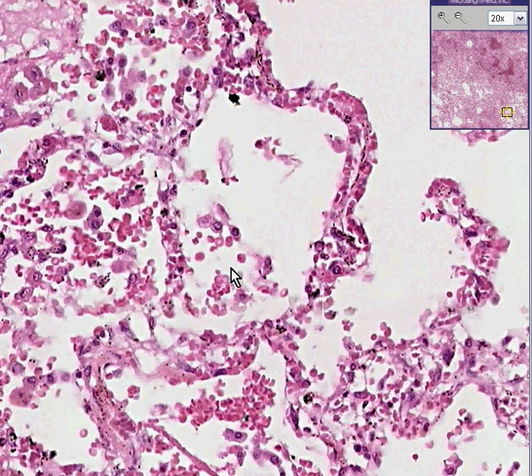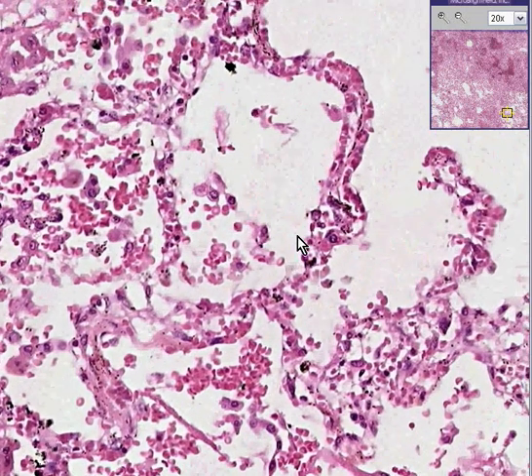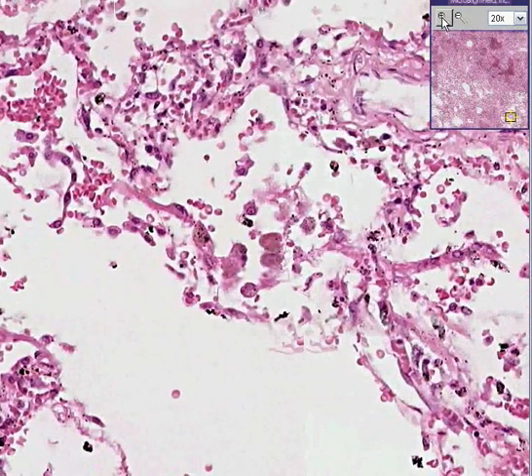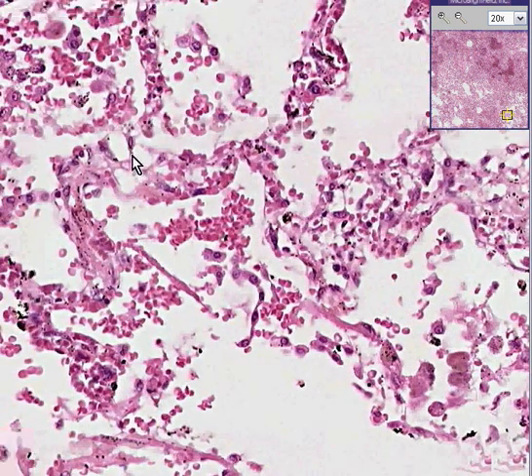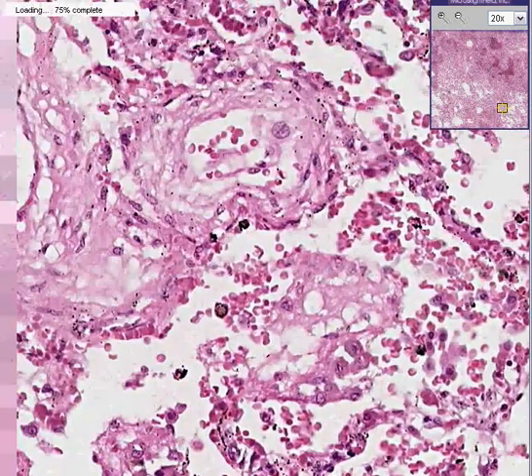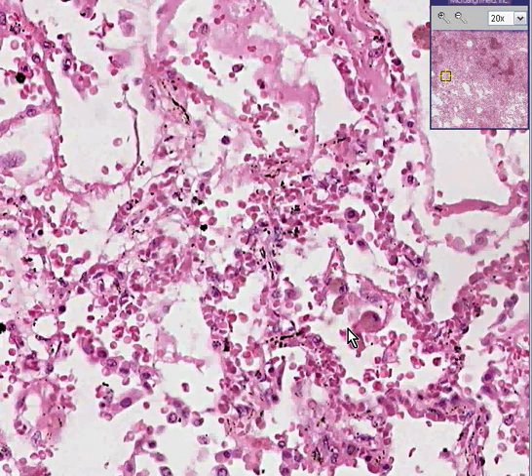If the lung was congested severely enough there would be acute pulmonary edema or fluid within the alveolar spaces. If it was congested chronically enough, you would see a considerable amount of macrophages within these alveoli that are loaded with a chronic blood pigment or hemosiderin, like you see here. This is generally a very acute passively congested lung — you are not seeing too many of these hemosiderin macrophages, and you're seeing mostly significant congestion of blood vessels within the septa and not so much actual edema within the alveoli. This case shows very good examples of acutely congested lungs and livers. Thank you very much.